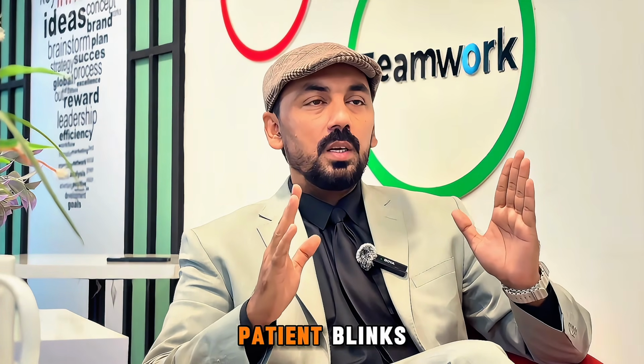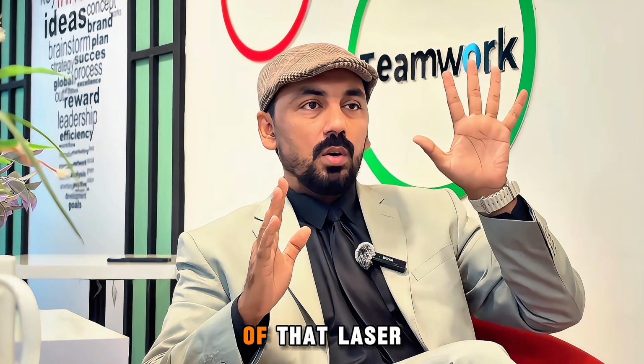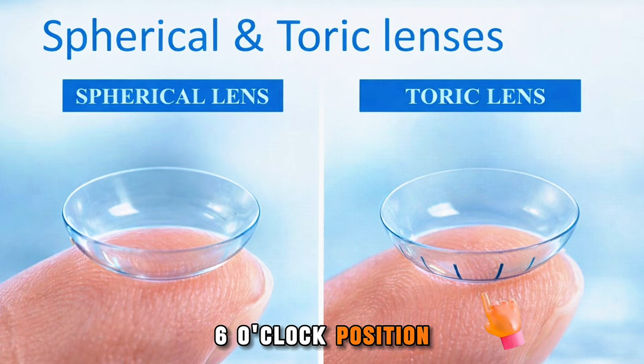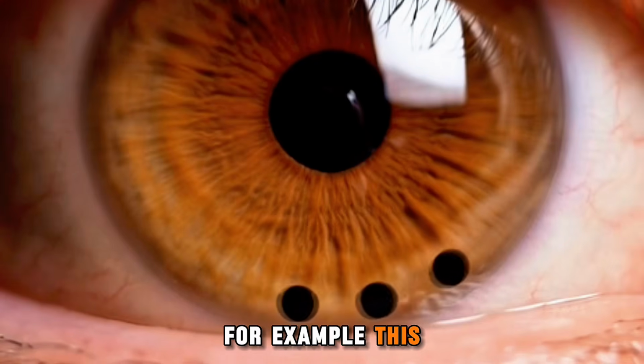But when the patient blinks and the laser lines move from the 6 o'clock position towards the left side or towards the right side, this is a problem.